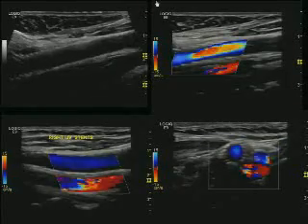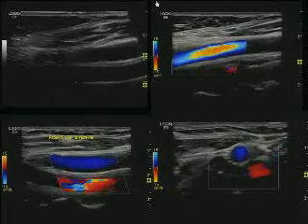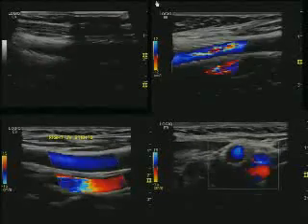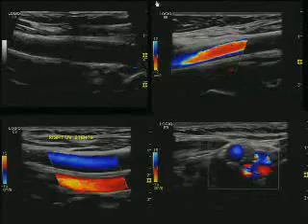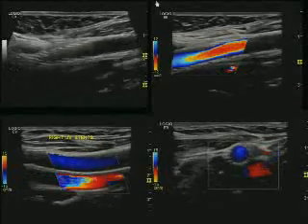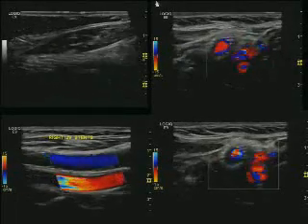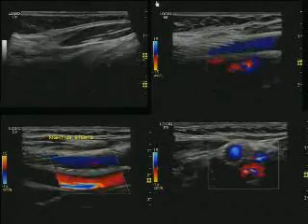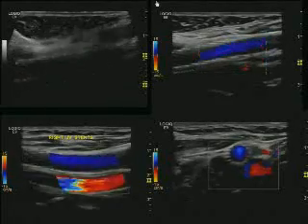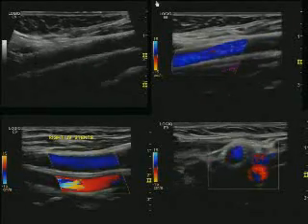She underwent 2 angioplasties in Athens, and the result was total occlusion of the left side, and Dr. Sclafani put many stents on the right side to treat the multiple stenosis. And you can see the result. It's amazing. You can see the stents.